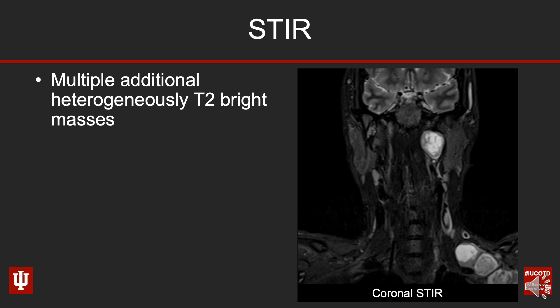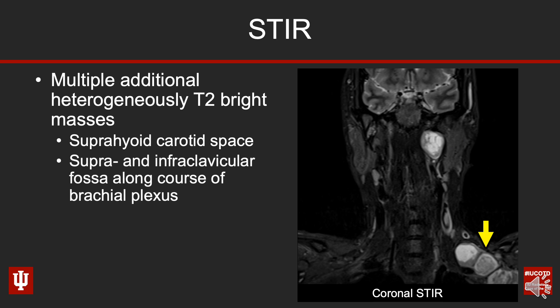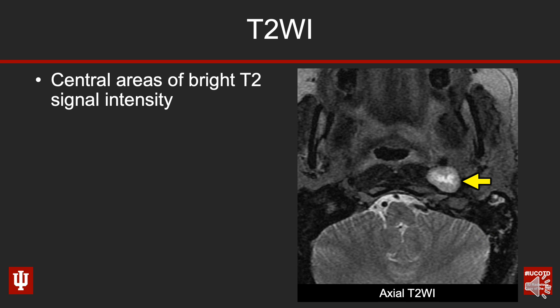Next up is the coronal STIR image. You'll see there are additional masses within the neck — the one in the supraglottic larynx wasn't the only one. The yellow arrow is pointing to a mass found in the suprahyoid neck in the carotid space, adjacent to the carotid artery. We also have additional masses in the supra- and infraclavicular fossa on the left, coursing along where we'd expect the brachial plexus — an important clue to help come up with the diagnosis.